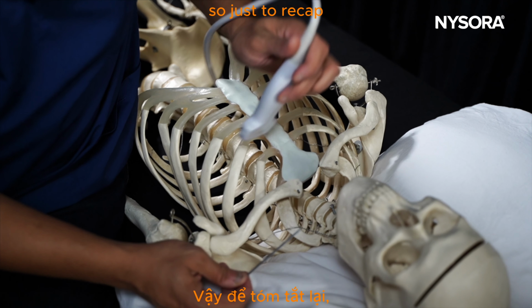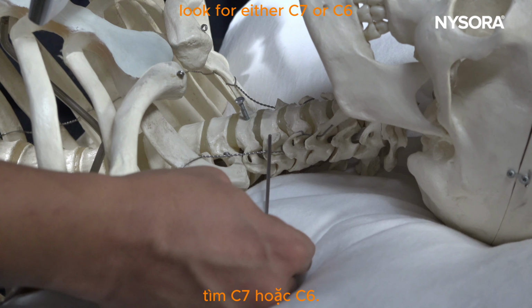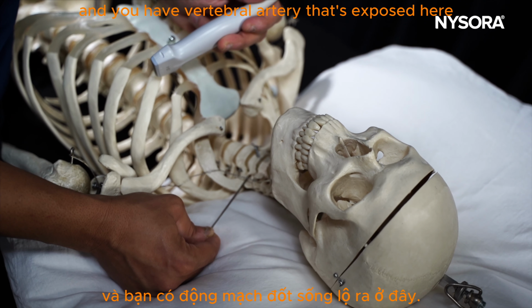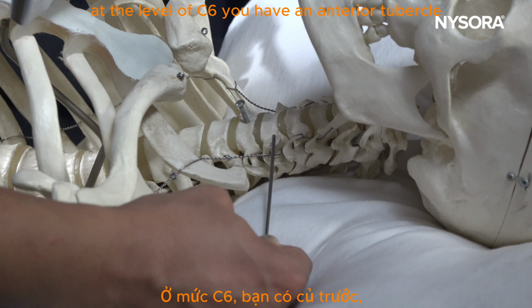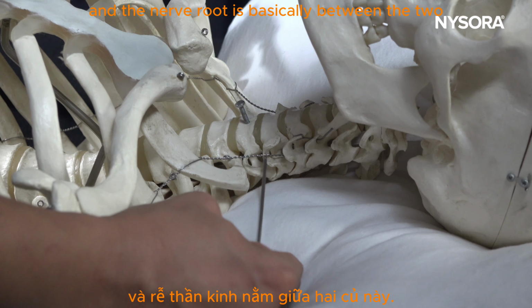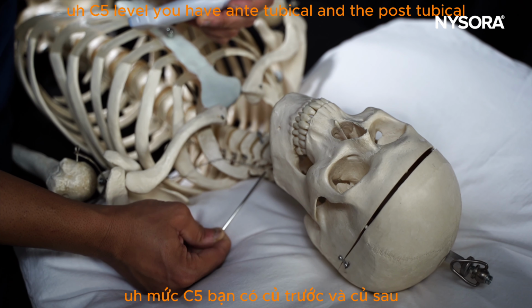So just to recap, start from the midline, scan, move laterally, and look for either C7 or C6. At the C7 level, you don't have an anterior tubercle, you only have a posterior tubercle, and you have the vertebral artery that's exposed here, and then you have the C7 nerve root. At the level of C6, you have an anterior tubercle and posterior tubercle, and the nerve root is basically between the two. Same thing happens at the C4 and C5 levels, where you have an anterior tubercle and the posterior tubercle.